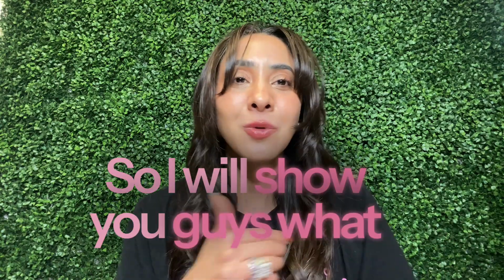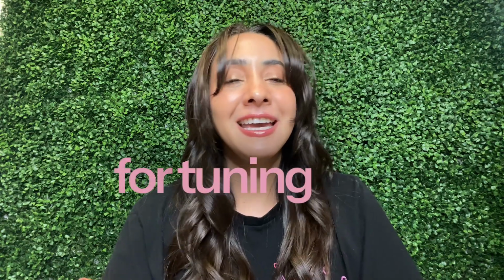So I will show you guys what that looks like, and thank you for tuning in and listening.